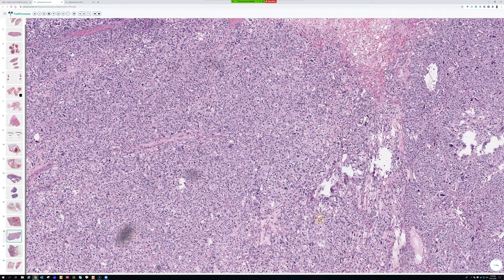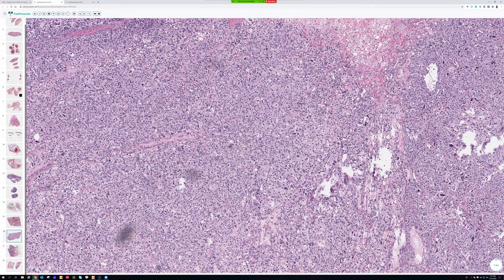In general, if you see a sarcoma in the extremities with lipoblasts, that's going to be pleomorphic liposarcoma the vast majority of the time. Dedifferentiated liposarcoma can sometimes have lipoblasts, but the most common location for DDLPS is the retroperitoneum, though I've seen a handful in the extremities. If you really want to know, you can do MDM2, which is almost always negative in pleomorphic liposarcoma and almost always positive in DDLPS.